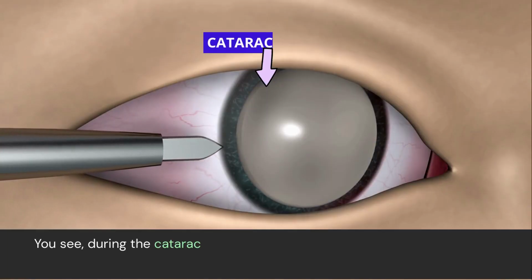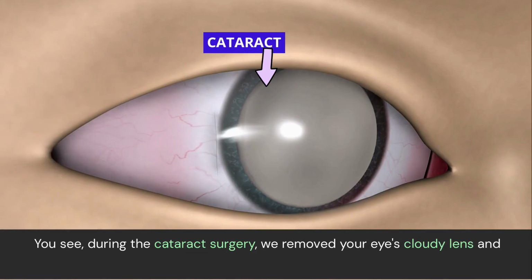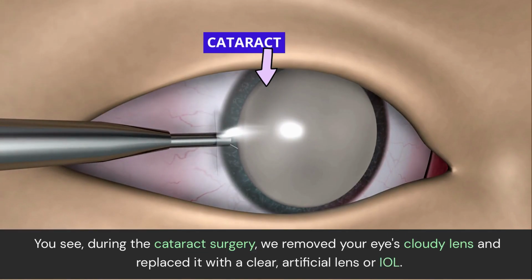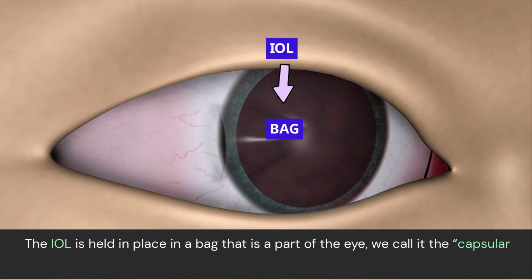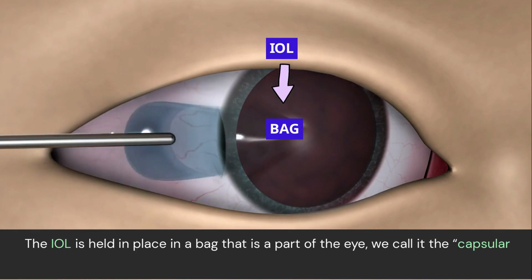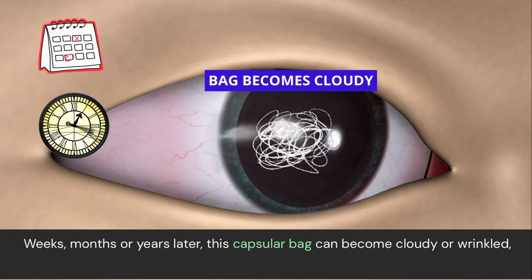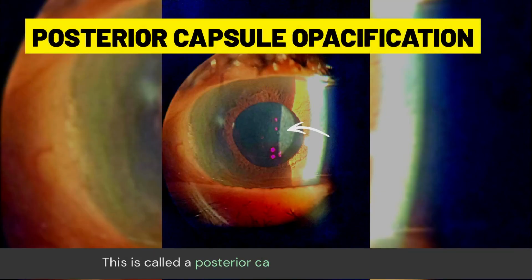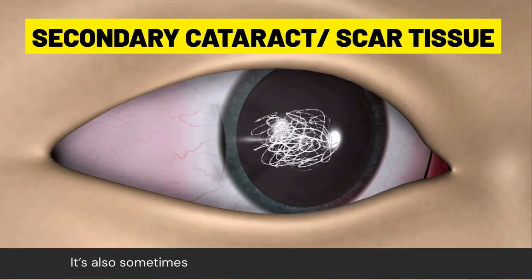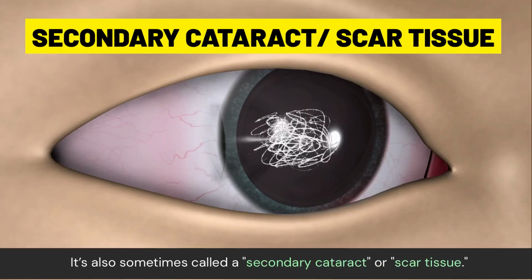If you remember during your cataract surgery, we removed your eye's cloudy lens and replaced it with the clear artificial lens called IOL. Now that IOL is held in place in a bag that is a part of the eye. We call it the capsular bag. Weeks, months, or years later, this capsular bag can become cloudy or wrinkled and cause blurry vision. This is now what you call a posterior capsular opacification or PCO. It sounds like a mouthful, but other names would be secondary cataract or scar tissue.